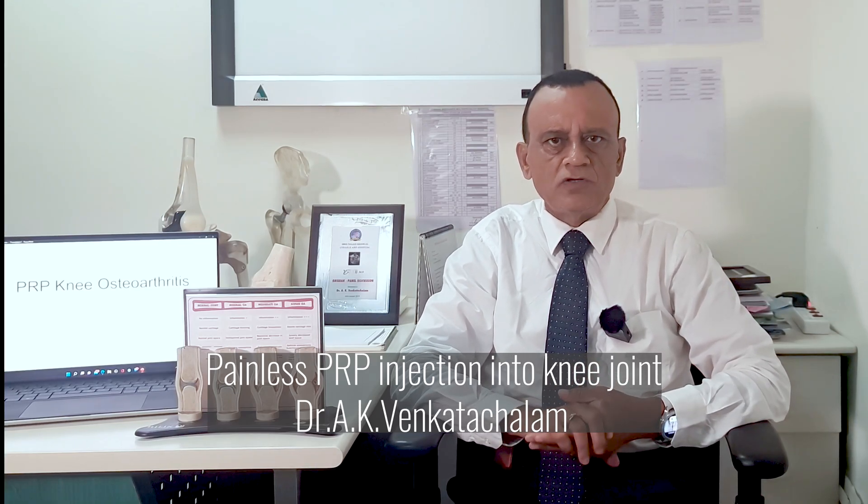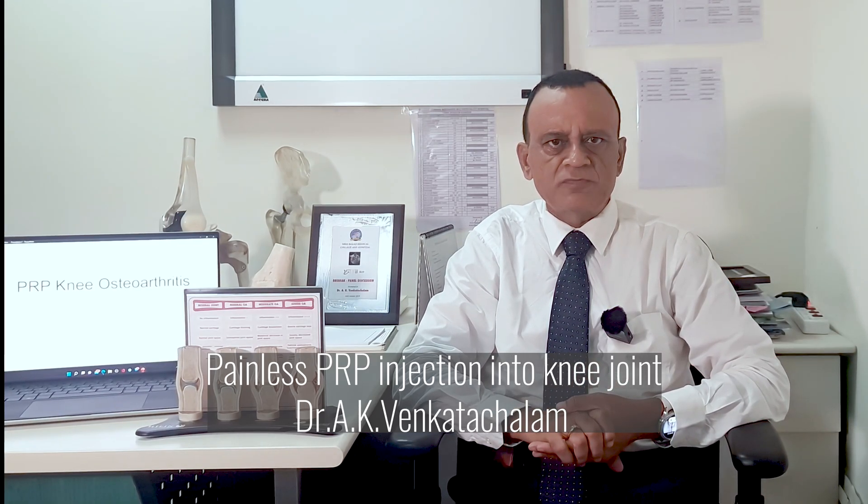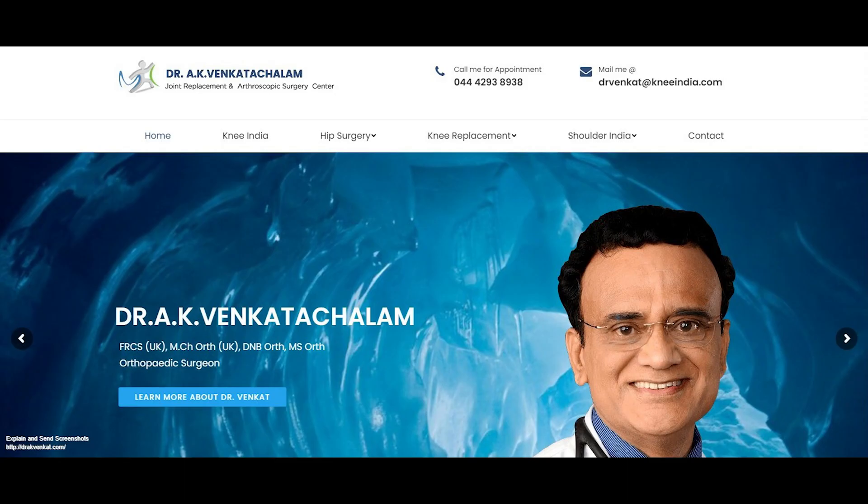In this video, I will show you how platelet-rich plasma or PRP is injected painlessly into the knee joint of a patient. Platelet-rich plasma is a biological substance prepared from your own blood. It is effective in relieving pain from mild and moderate cases of osteoarthritis in younger patients.